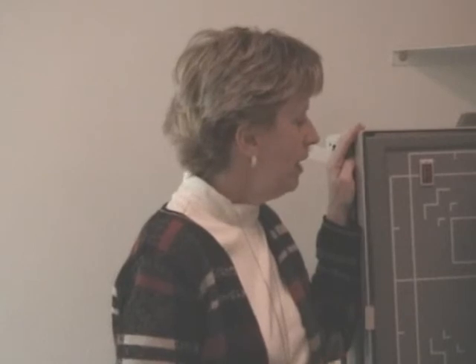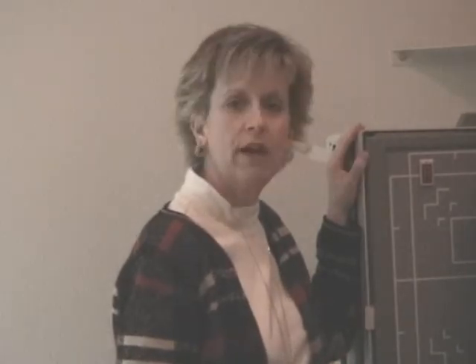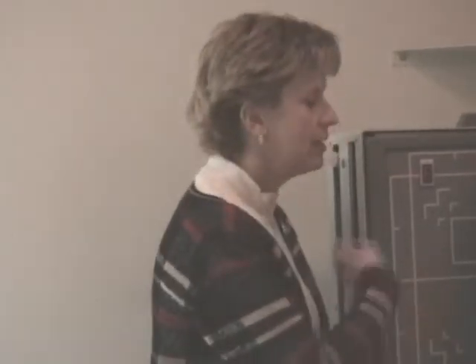Your image on the x-ray, if it's at a 45-degree oblique, the affected side, the side of focus, will be twice as wide this way as the unaffected side. Okay, you can actually measure and see that. Do not x-ray tabletop. Get as much of the rib cage on there as possible, because the patient fell or they hurt themselves. They might have injured themselves in a couple of locations but are only feeling the pain in one. So make sure you get as much of the rib cage on there as possible.